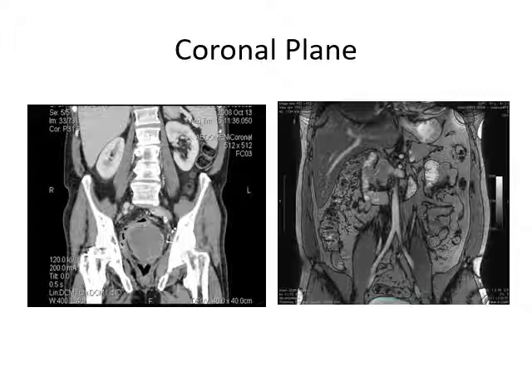Here's that aorta flowing through and breaking off down into the femoral arteries. You can see the kidney quite clearly here, but on this one you can't see the kidney very clearly. I think it's back here somewhere, but it depends on how deep the cut is as well. Anyway, you can see the differences between the two, and we're going to talk about that before we finish this video.